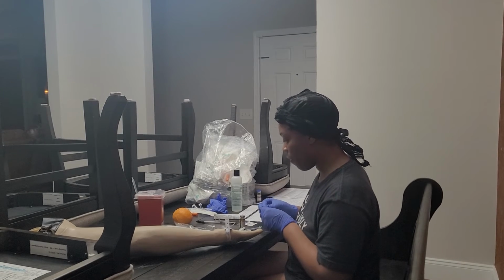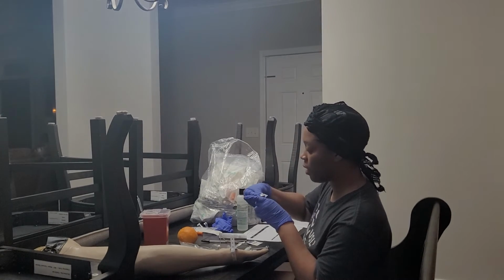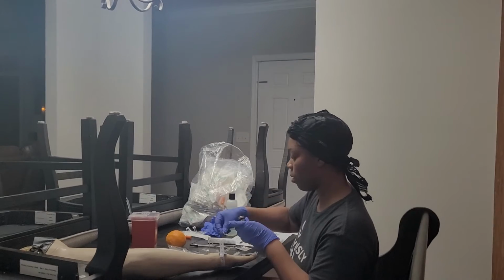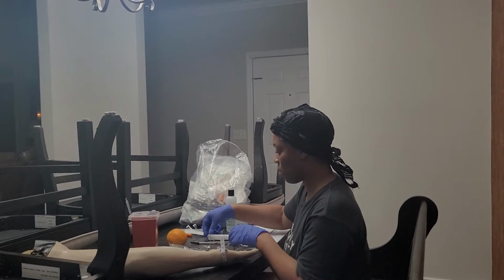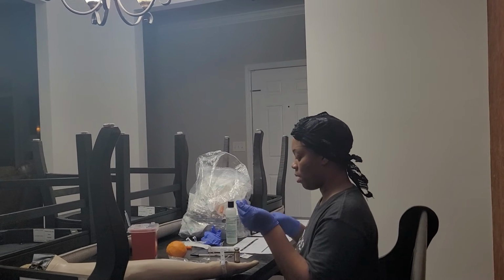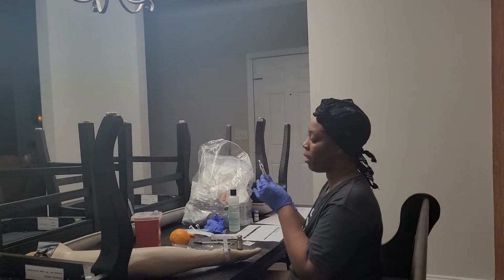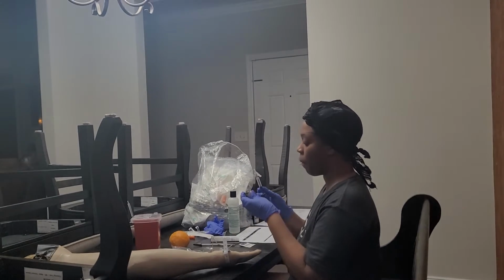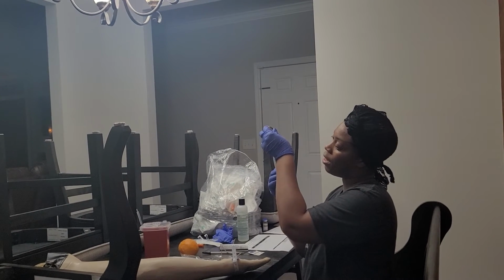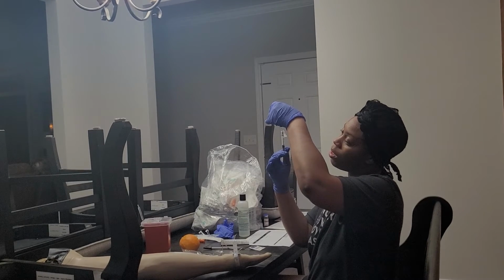So the first thing that I'm going to do is clean off the top here. I'm going to pull back to 2 mLs. I'm going to put 2 mLs of air, and then I'm drawing back very easily to 2 mLs.